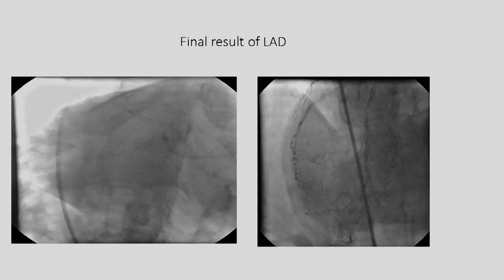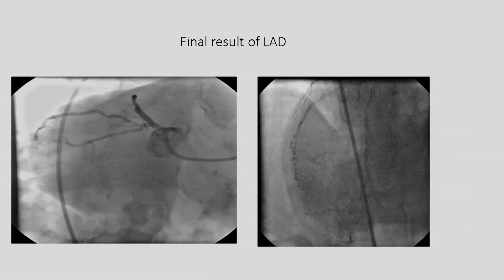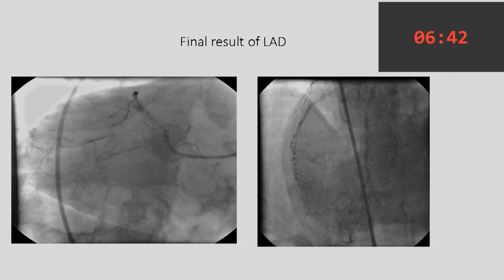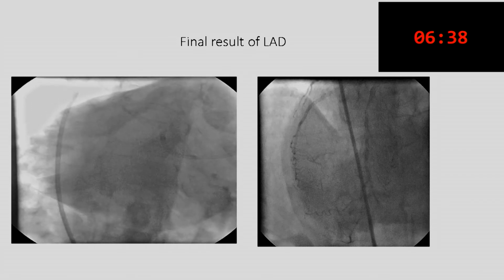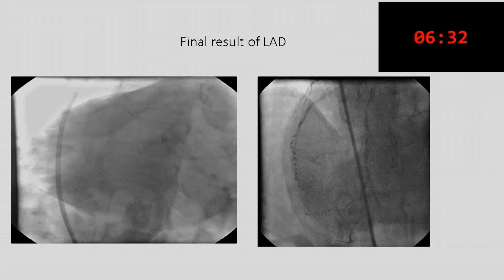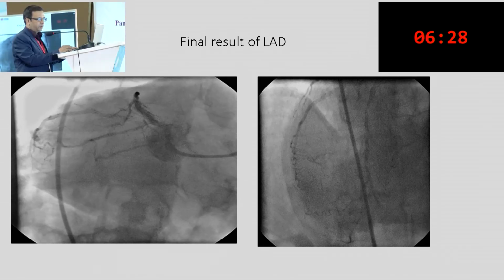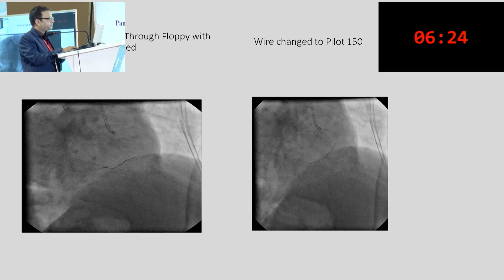But after that, when I tried to complete my procedure, the party came to me and said, sir, please complete the RCA also. I repeatedly refused because I think this is a CTO. But they were thinking that, as most of our patients have a low budget, they are trying to finish this second work within this budget.